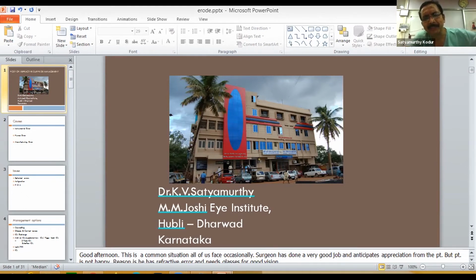Usually most of the people settle down if it is a small number, and then give them glasses or contact lenses. In case that doesn't work, then there are other options like IOL exchange, or we can put another lens. This is called the piggyback lens or supplementary IOL or add-on IOL, or one can do laser vision correction, or one can implant a phakic IOL.